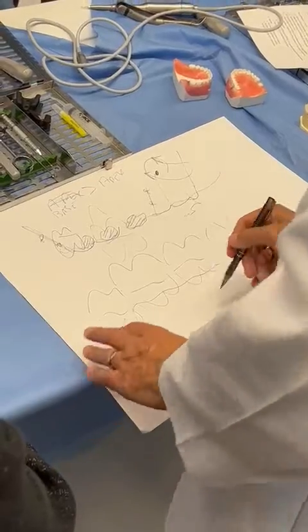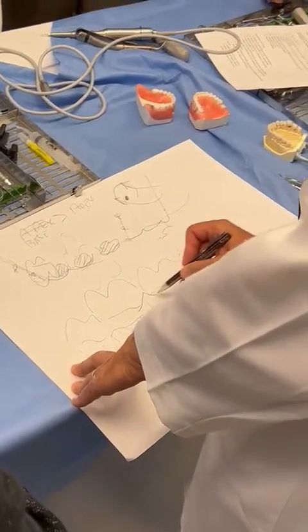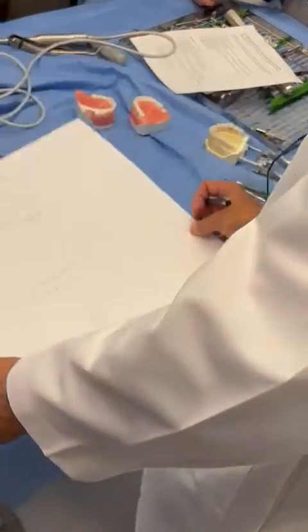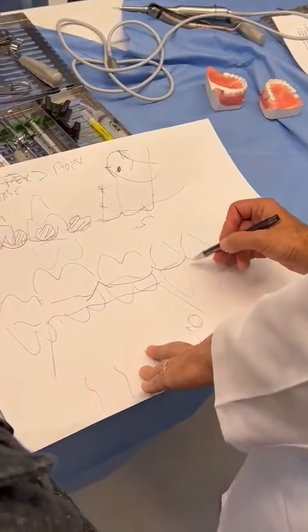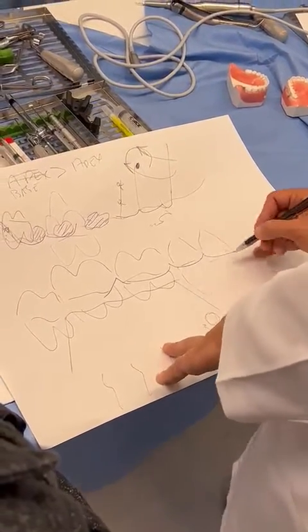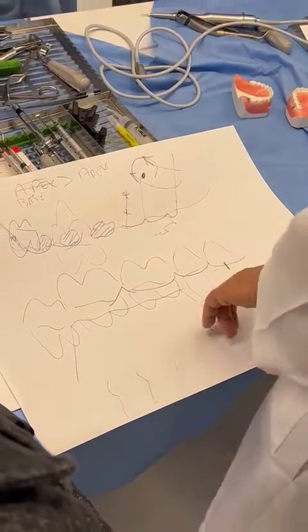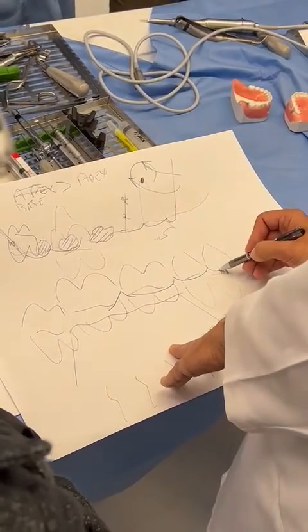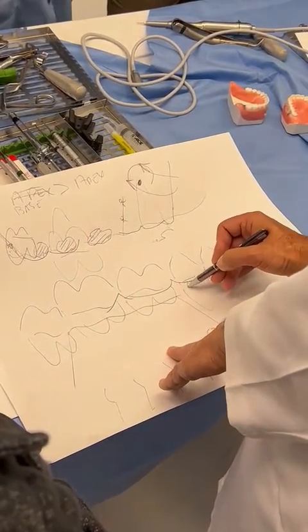So here's what we're going to do. We'll take out 30. We're going to take 1 papilla, and we're going to take 2 papilla forward. Okay? This is the embrasure space. Okay? And where are you going to go when you go to the second papilla? I like to stop mid-line angle, facial line angle of this tooth here. So we're going to take that. We're going to take this.